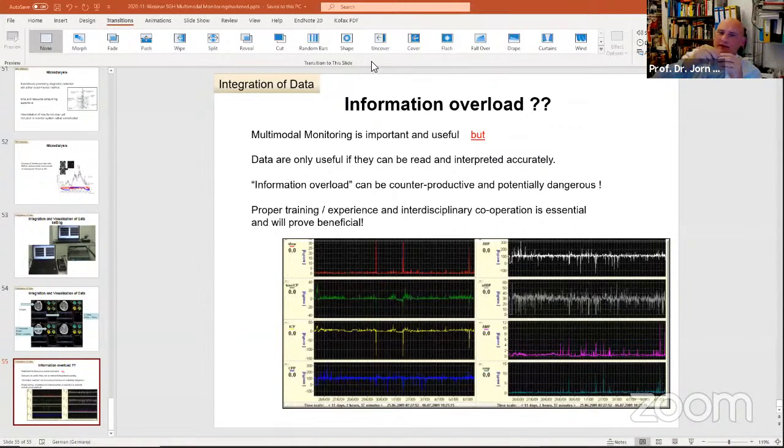We use a transducer, the same as for the arterial pressure, for instance. You can use that as well. And the good thing in infectious patients is that you can get CSF out of your probe, of course, out of your drain. Analysis, cells, and whatever. You can actually, although that is not always accepted, do some treatment as well. Some people give vancomycin, but it's more experimental. But that's also possible, of course, if you have ventriculitis.